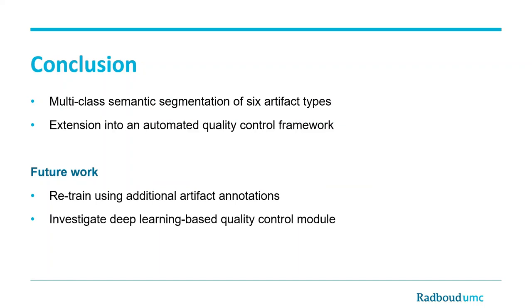In this work, we developed the first deep learning-based multi-class semantic segmentation network that is trained to detect six different artifact types. We also showed how this network can be extended into an automated quality control framework to assist pathologists in routine clinical practice. In future research, we aim to collect more annotations of rare artifact types and retrain the artifact segmentation module in order to make it generalize better to unseen data.